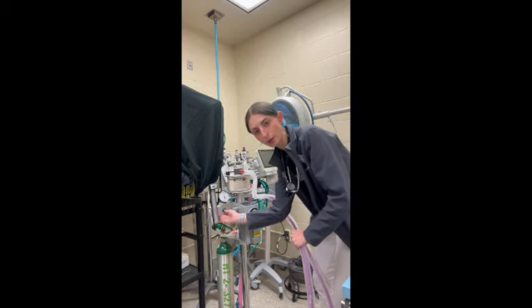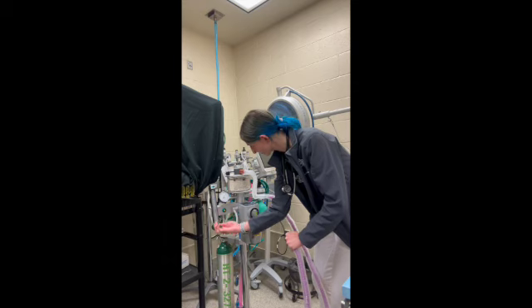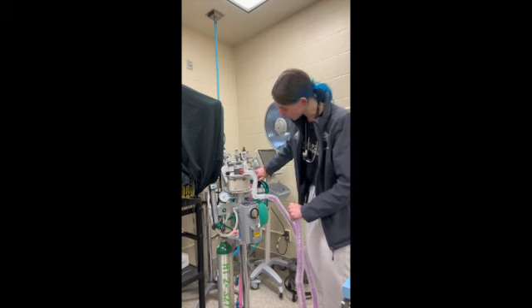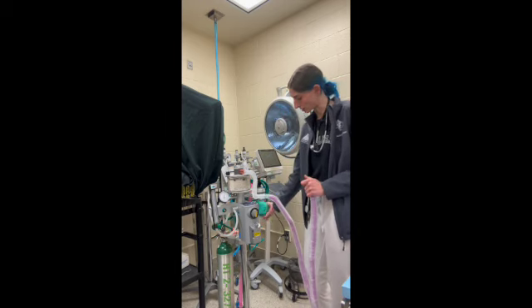All right, and then you want to flush your oxygen bag and set it to about 20 centimeters. I'm going to watch our pressure gauge and see if it moves at all. It looks to me like it's holding. So now we will just open our pop-off valve and release all of our excess pressure.